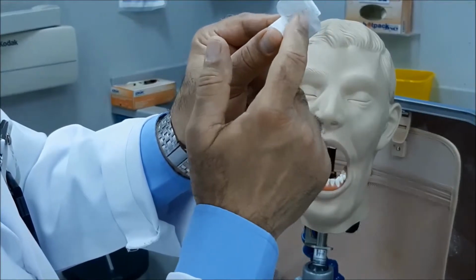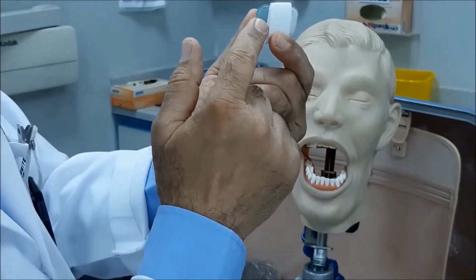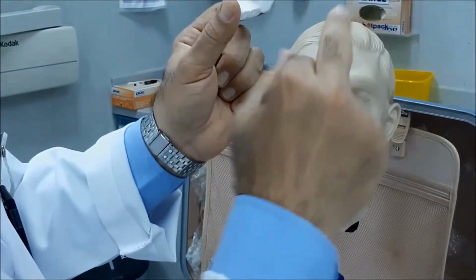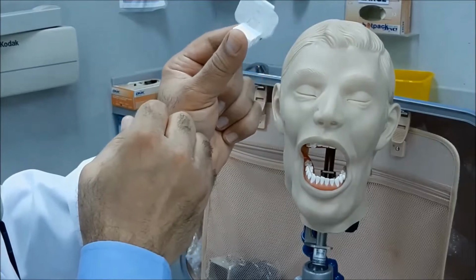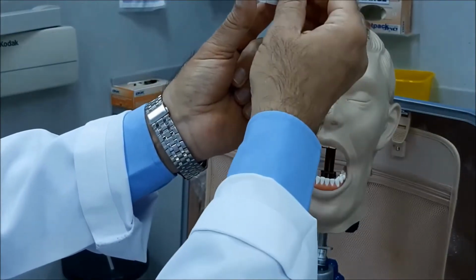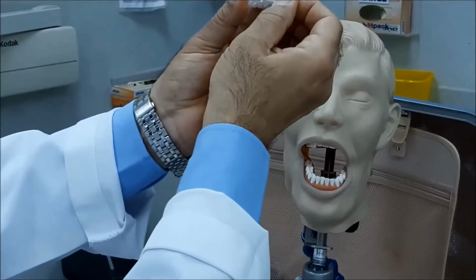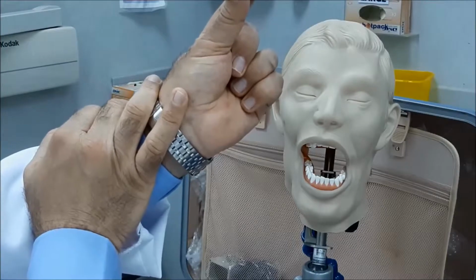And make sure, please, that this will be the exposure side, and this will be the back side of the film. We don't want the sensor to be radiographed or exposed to radiation from the opposite side. So you put it midway. Make sure that it doesn't slant in either direction. So this is how it is placed correctly.